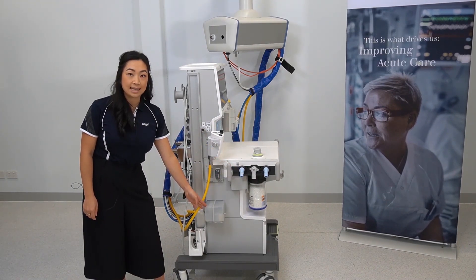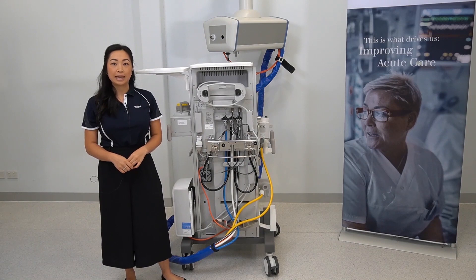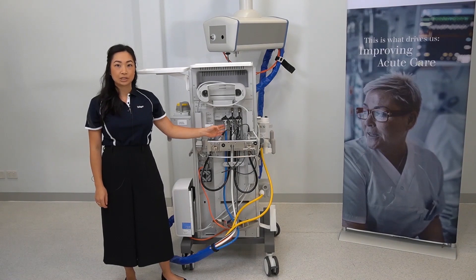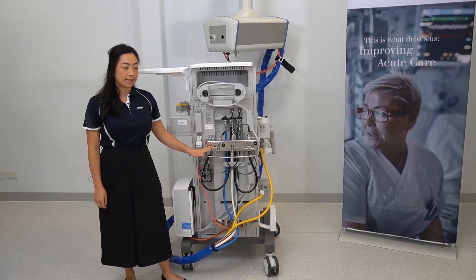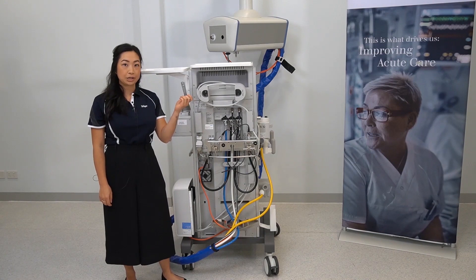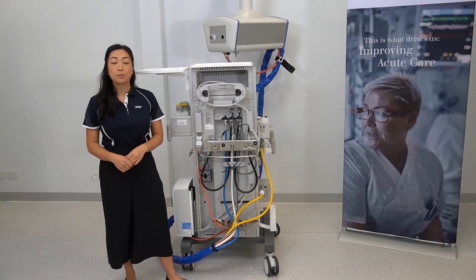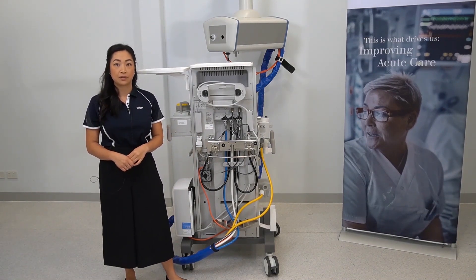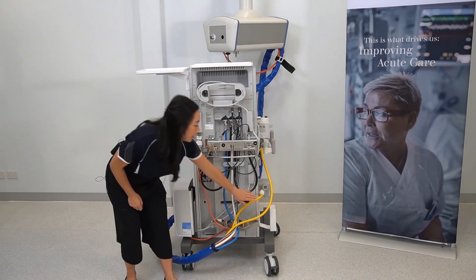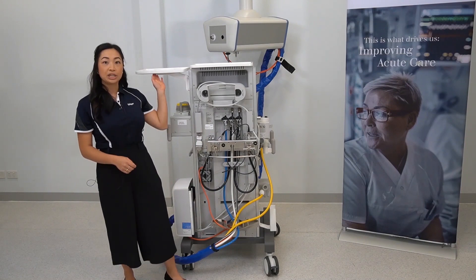This is a side view of the anaesthetic gas scavenging system. Now we are looking at the back of the ATLAN A350. Located here are the hoses to connect to the central gas supply system. You can mount your reserve gas cylinders here. Attached to the device is a wrench for opening certain cylinders. Located down here is a power switch which may be switched off during storage of the device — this will need to be switched on to operate the ATLAN A350. Located on the back of the anaesthetic gas scavenging system is a hose that connects up to your scavenging or suction system.